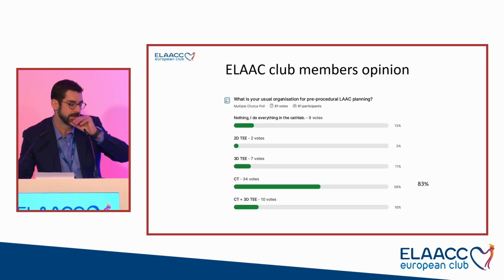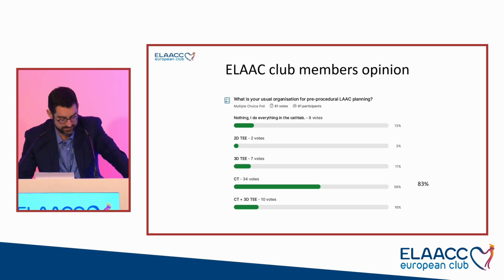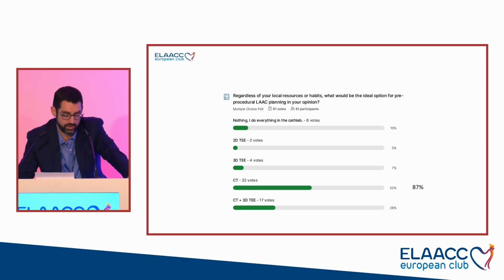So what about the ELAACC member opinion? I think most of us in the room are convinced by the utility of 3D modalities. You see that 83% of you use 3D modalities for upfront planification. Is it a problem of resources for the others?